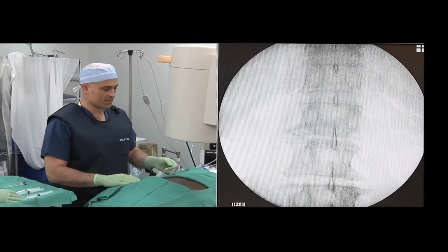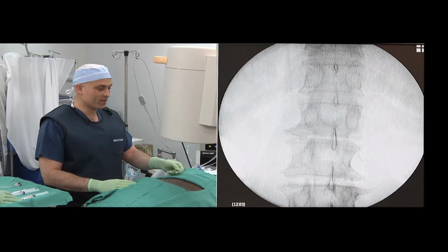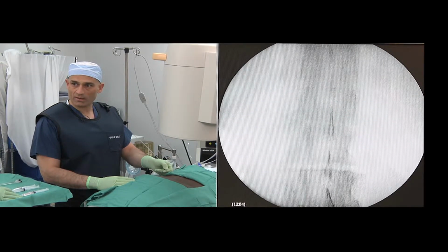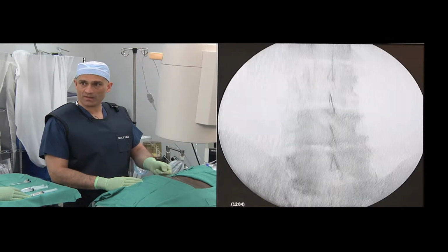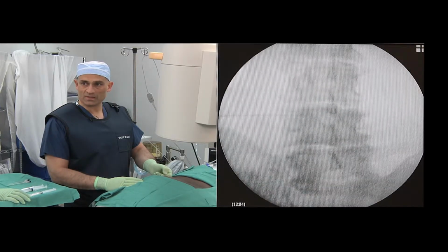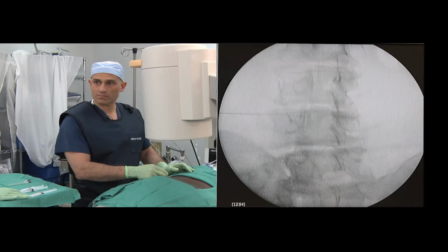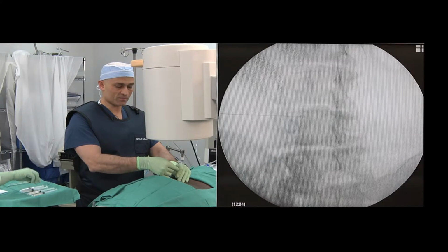The procedure commences with the identification of the correct lumbar levels, and we move the C-arm to the T12 level, and we count down from T12, T12, L1, L2, L3. The L3-4 facet on the left side is identified by the presence of the needle tip. The C-arm is then rotated in an oblique fashion, opening up the lumbar facet joint. The needle is then advanced under fluoroscopic guidance into the joint.